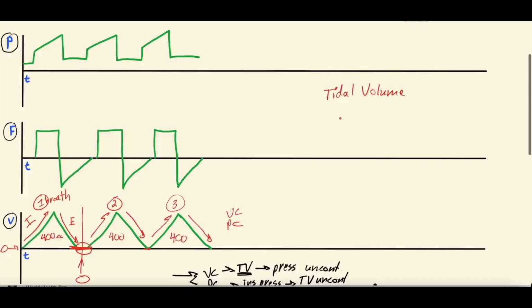So if we talk about ventilators, oftentimes there's 3 things we think about with each breath. The trigger, or when the ventilator decides to give a breath. The target, or what the ventilator is targeting, because it needs to target something, right? It's a ventilator, it's not a human, it can't think. So you have to tell the ventilator, I want you to target X with this breath. And then the cycle, or when the ventilator stops the breath. So the trigger, when the ventilator decides to start a breath, the target, or what it targets during that breath, and then the cycle, when it decides to stop a breath. And in volume control, the trigger is time. Makes sense, right? We said we set a respiratory rate.